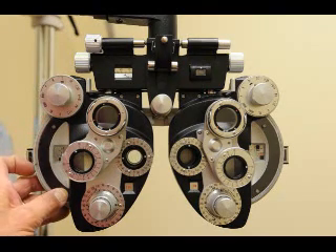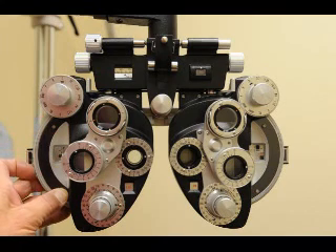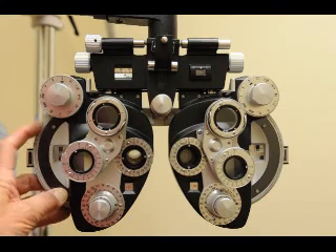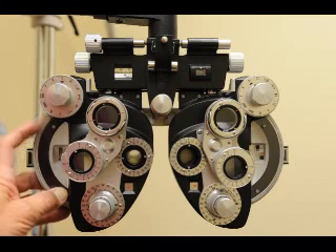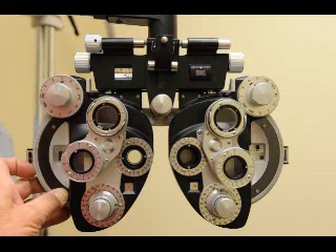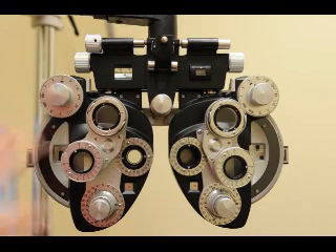Ask: 'Is it easier to read like this — number one or number two?' They say number two. 'Easier three or four?' They say three, so put it back to three. 'Is it easier five or six, or about the same?' Since the autorefractor is so accurate, it will likely be about the same. Suggest that it might be about the same — don't force them to make a choice at the endpoint when they can't tell the difference. So the sphere is done.